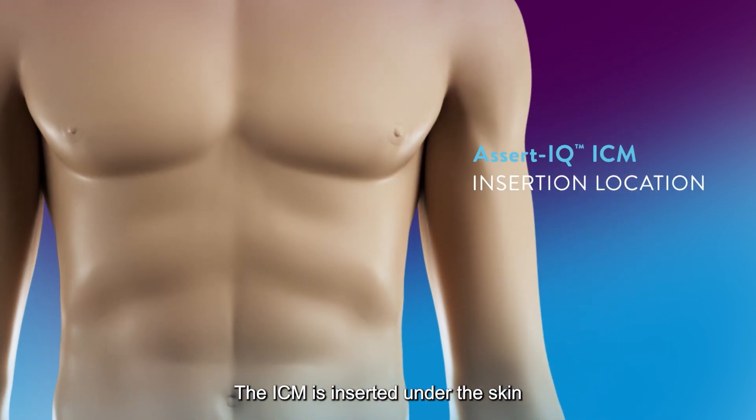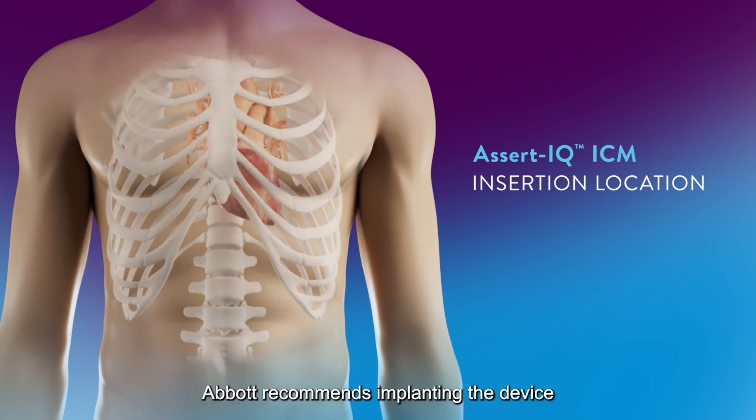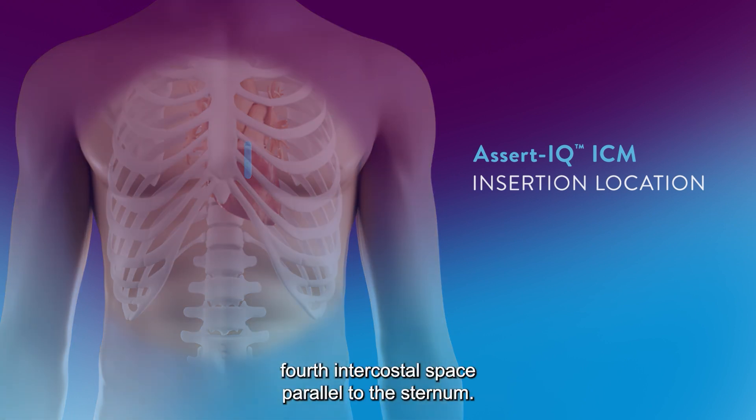The ICM is inserted under the skin in the left pectoral region. Abbott recommends implanting the device in the fourth intercostal space, 45 degrees relative to the sternum, along the axis of the heart. An additional insertion location includes the fourth intercostal space parallel to the sternum.